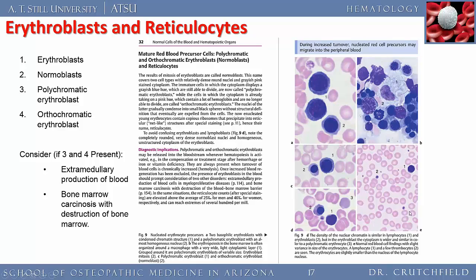They look pretty good. But erythroblasts give rise to a normoblast, and then these will stain either multiple colors or one color where they're no longer able to divide. So I don't like to read my slides, but I've got to read this one to you.